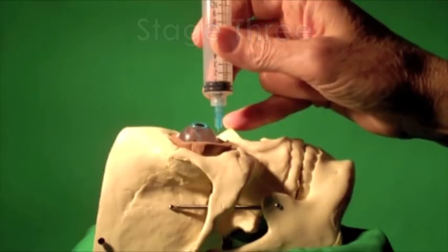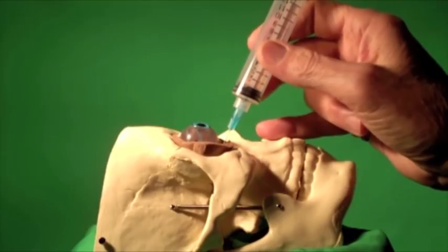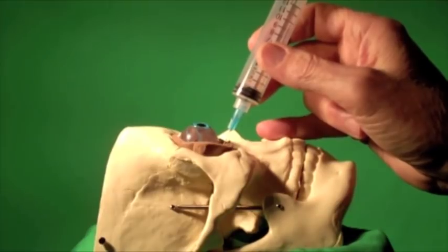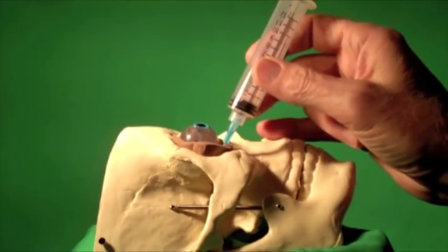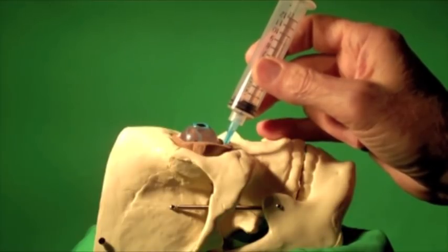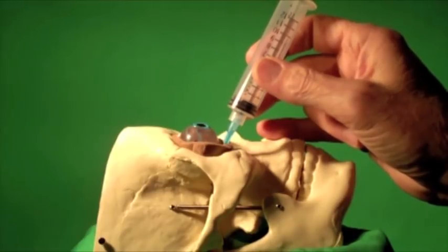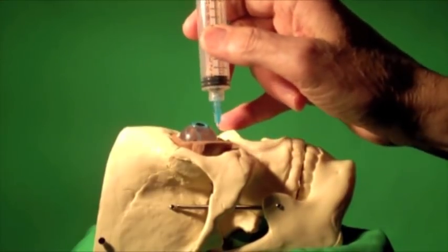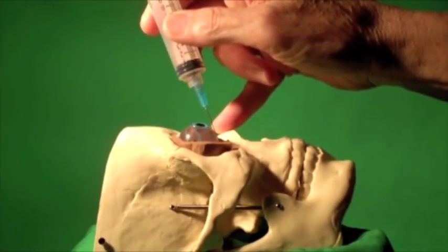Stage 3. The needle tip is rotated cephalad until the shaft of the needle rests gently on the infraorbital rim, about 60 degrees or less to the frontal orbital plane. Reassess your landmarks and then slowly advance the needle tip into the mid-orbital space to a depth of 25 millimeters or 1 inch, measured from the infraorbital rim. The tip of the needle is now positioned in the intraconal retrobulbar space. After negative aspiration, inject the local anesthetic at the rate of about 1 milliliter every 6 to 8 seconds until the orbit is full. Reversing the insertion technique and withdrawing the needle angled at 120 degrees towards the orbital floor will avoid the needle tip pointing towards the globe.